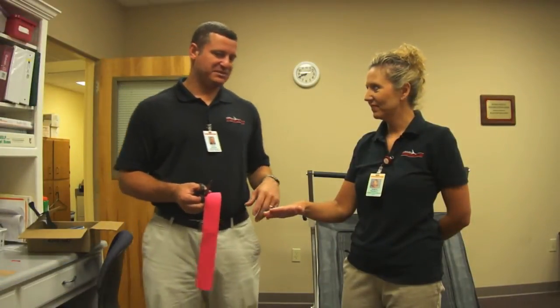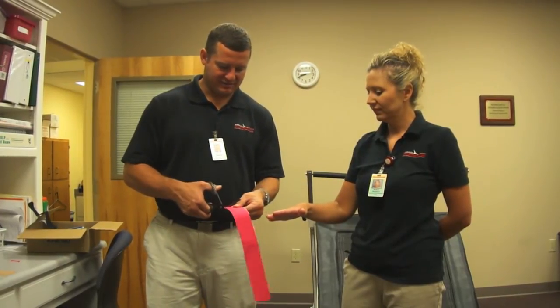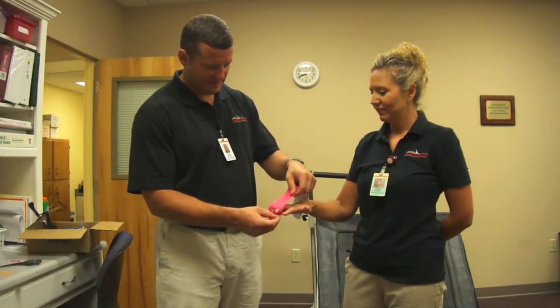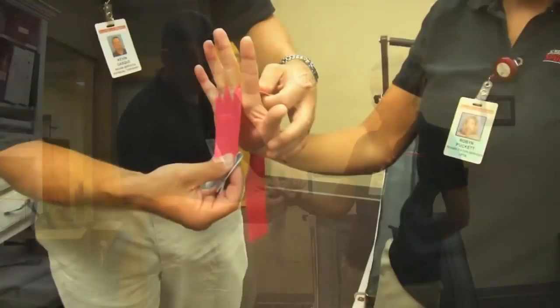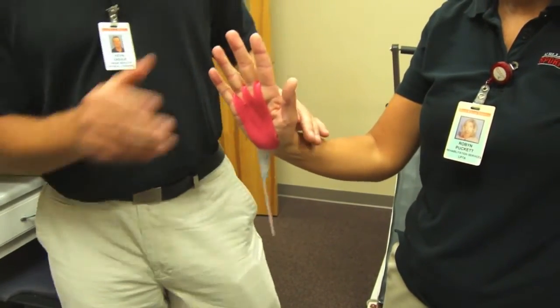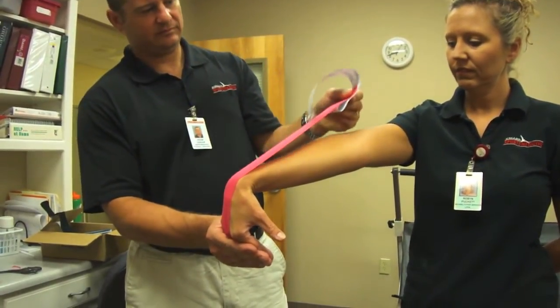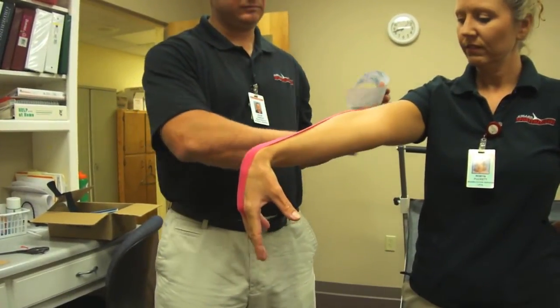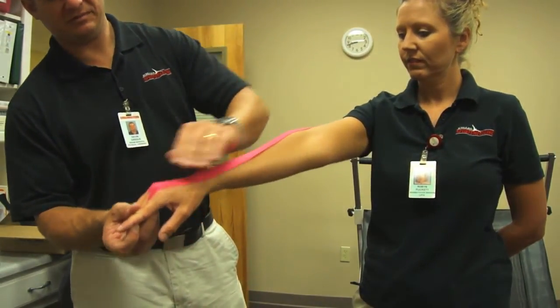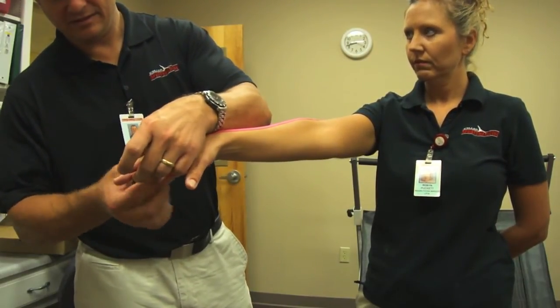For somebody that's having a lot of elbow tendonitis or tennis elbow, golfer's elbow, or swelling in their hand, this is a good hand one to do. Again, this is something that can be worn several days. You shower with it, bathe with it. It's actually pretty comfortable.